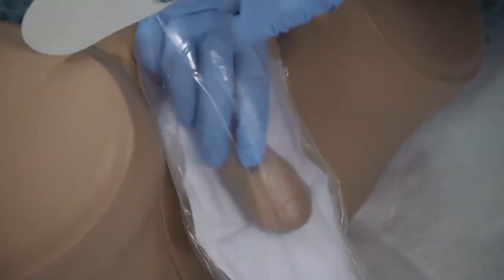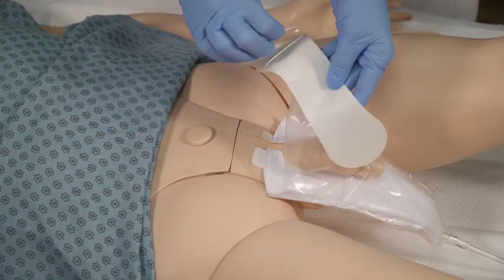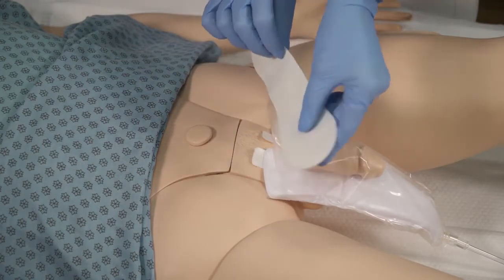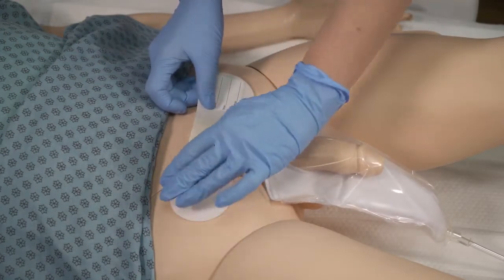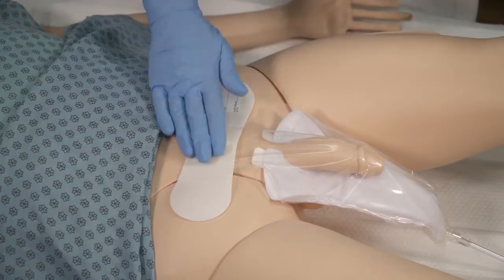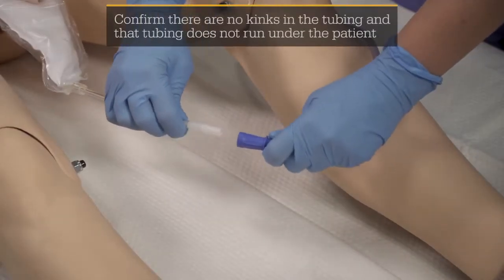Position the patient's penis into the wicking chamber. Remove the adhesive pad liner. Pull the device up until it's fully extended over the patient's penis and suprapubic region.